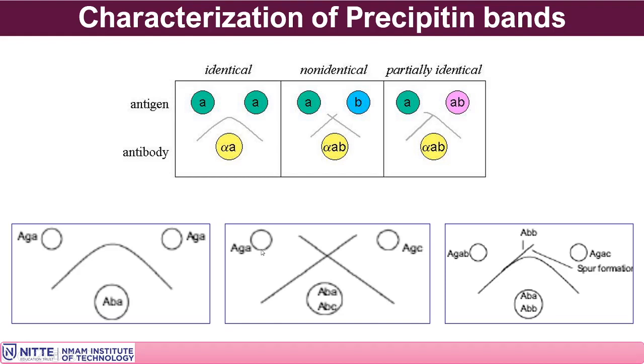The reason being the diffusion force exhibited by both the antigens, one. Second, they are different in nature. Their epitopes are different. Their determinants are different corresponding to that antibody. Because they are not identical to each other, they will show crisscrossing like this. This clearly indicates that the antigens being tested are dissimilar in nature. Therefore, it is called the line of non-identity corresponding to that particular antibody.